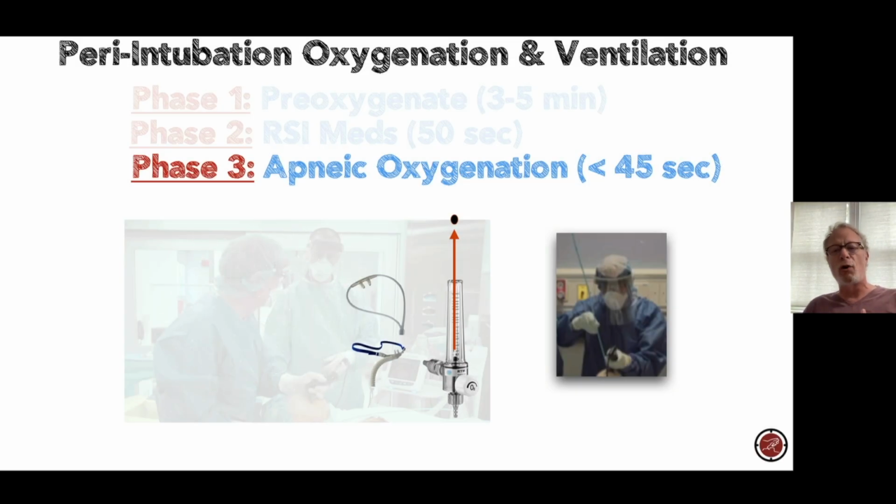If they've got abnormal lungs, as soon as we take off their mask, they're going to de-recruit those lungs. Sometimes in sick lung patients, I'll spend a little bit more money on them. I'll have the mask on and I'll have the humidified high flow on their forehead. And I'll drop that down during laryngoscopy, especially if I think it's going to be a difficult laryngoscopy, a difficult airway.